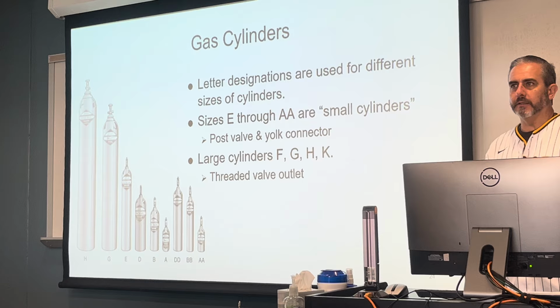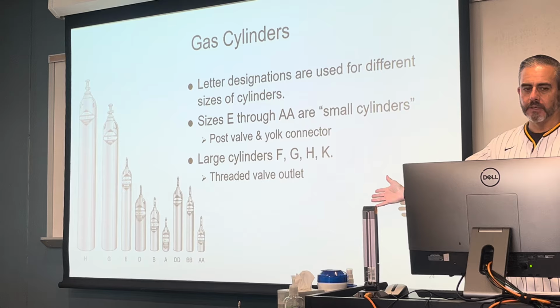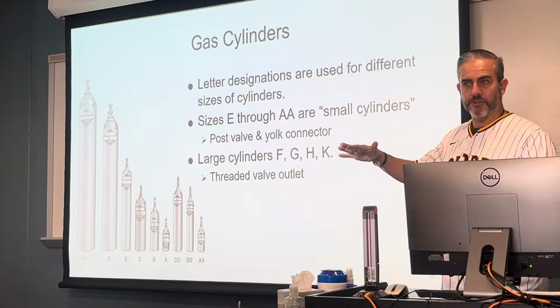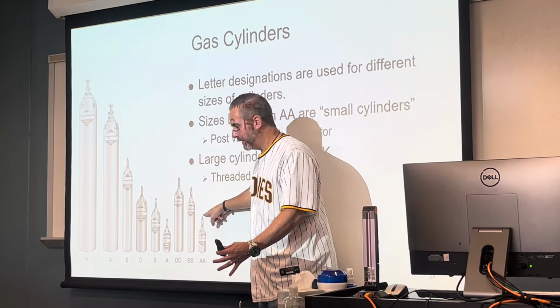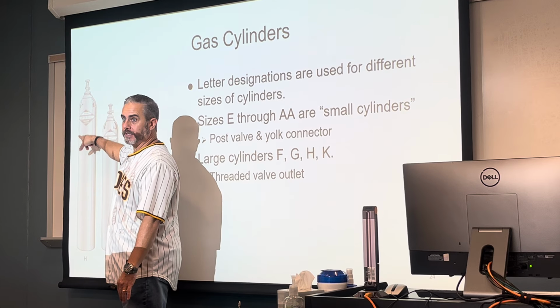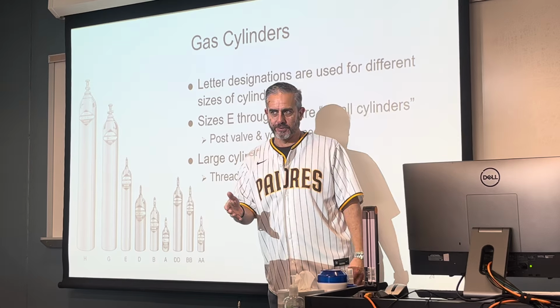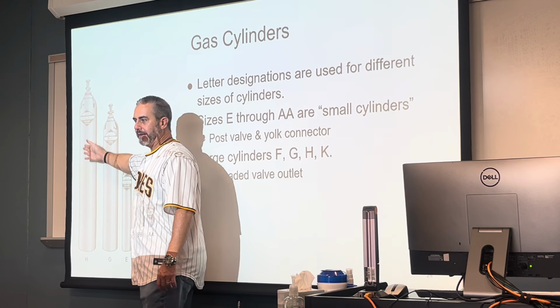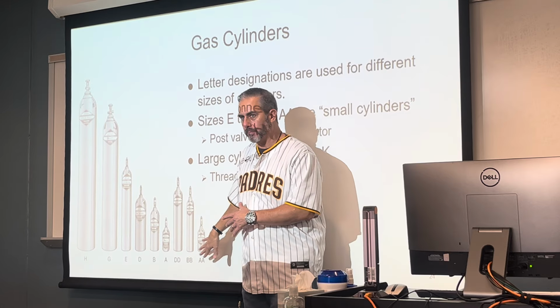All right, different size cylinders. There are more than just what's pictured here. Obviously, the bigger the tank, the more gas it's going to hold. If I pick this teeny tiny one, the AA, like a battery, that oxygen's not going to last very long, but an H tank is going to last much longer. Being practical, if I'm just going to the store and back, it's not practical to carry or roll the big one around. The small one would be much more convenient, but it's not going to last as long.